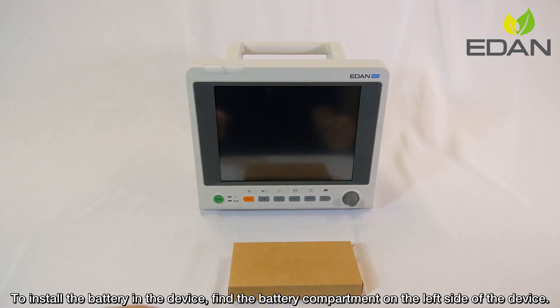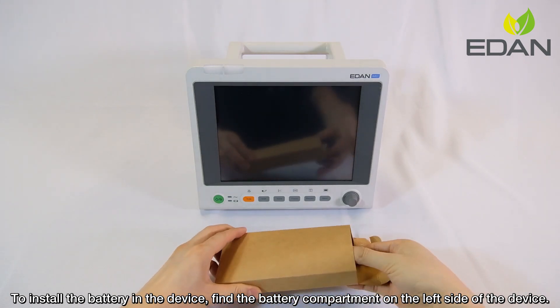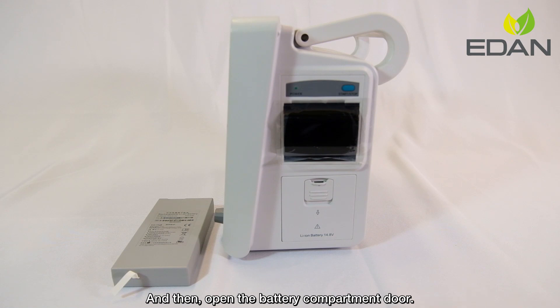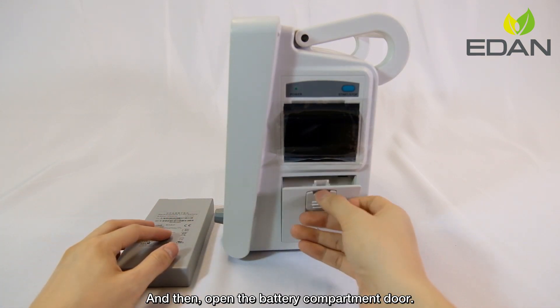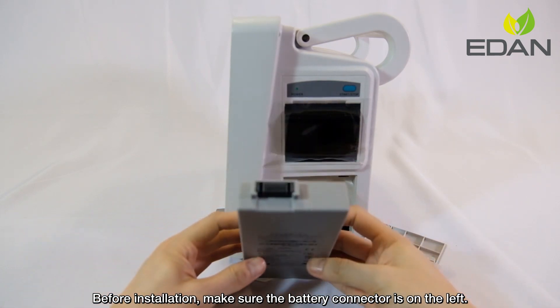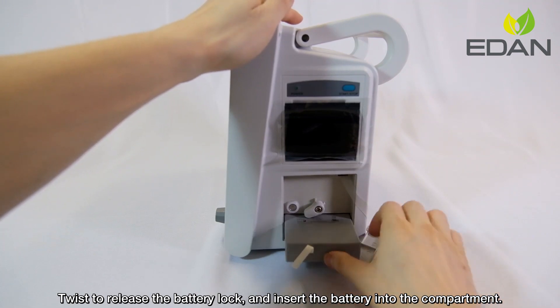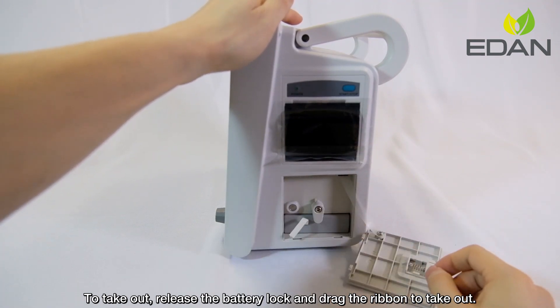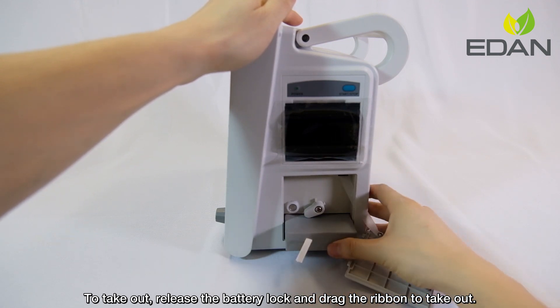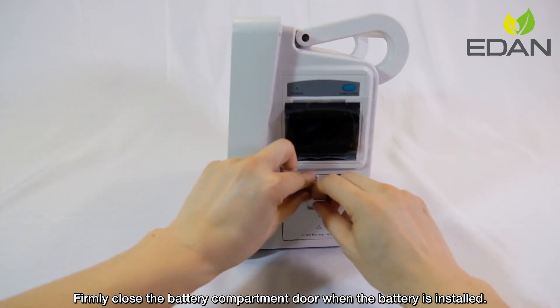To install the battery in the device, find the battery compartment on the left side of the device and open the battery compartment door. Before installation, make sure the battery connector is on the left. Twist to release the battery lock and insert the battery into the compartment. To take out, release the battery lock and drag the ribbon to remove it. Close the battery compartment door when the battery is installed.